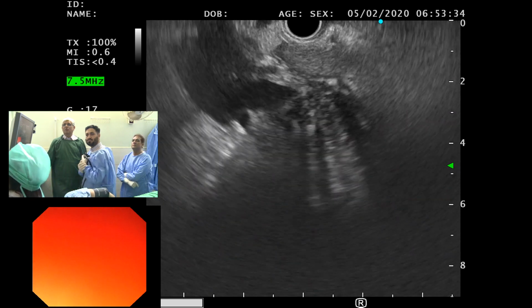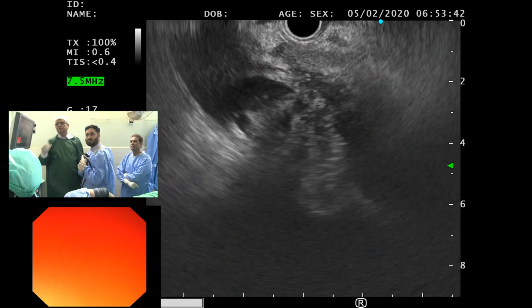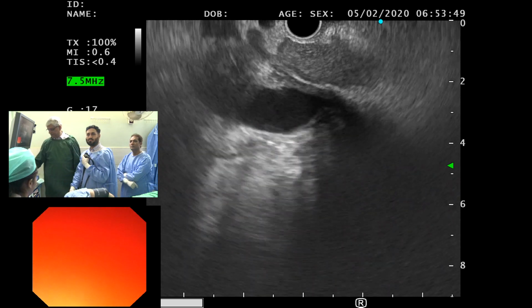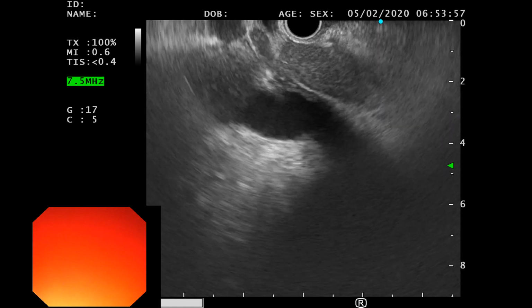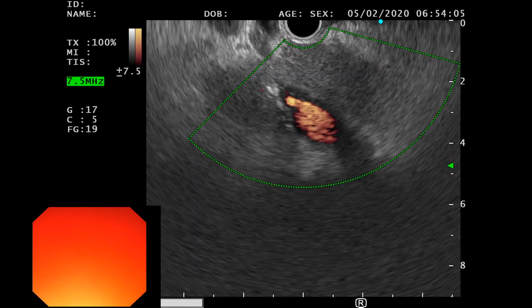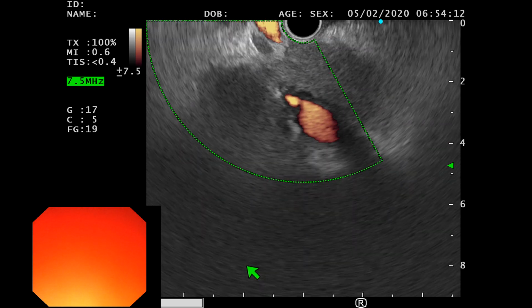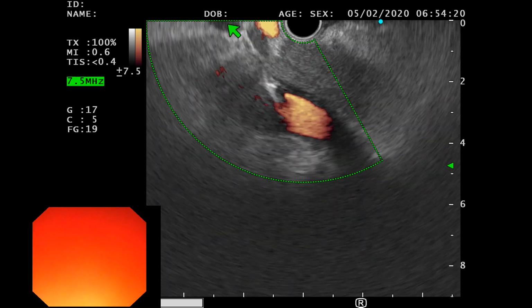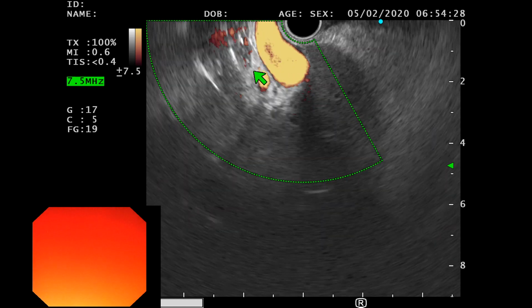See, this is what I saw when I was going in, so that's what I wanted to have a look. I'm not sure what. A little clockwise. A little pull back. See the lymph nodes there? Oh, sorry. Just go in a little bit. Sir, can you highlight the lymph node? I'll just do that. One lymph node there, and then I think there is also a lymph node, so we need to bring it towards us. So we go in, go anti-clock and see what that is.